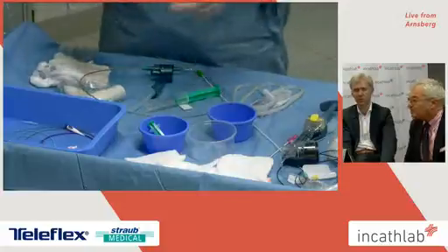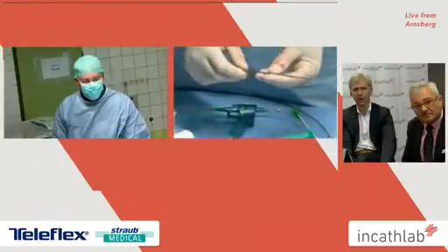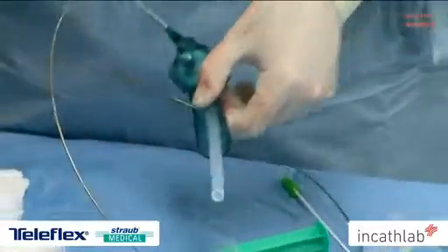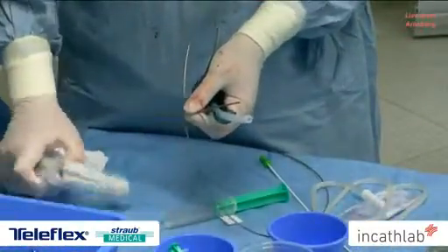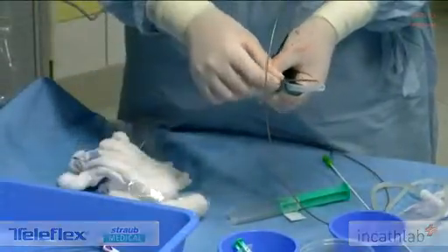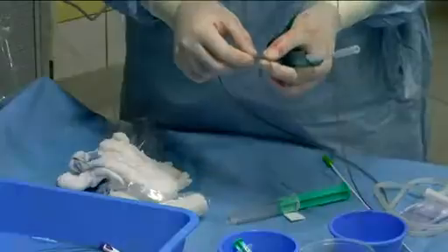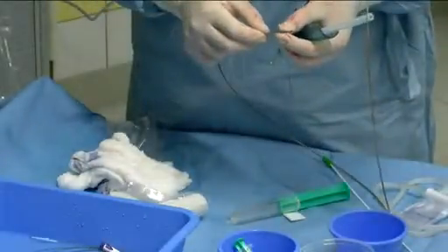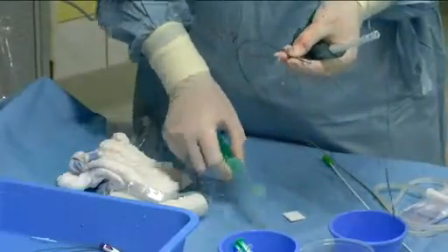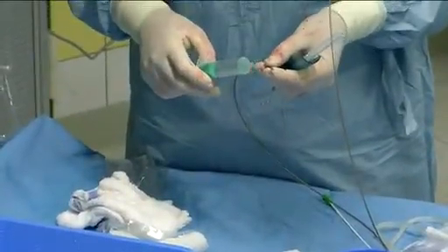Okay. So we are now coming to this case, and maybe this is the important part. Maybe we can turn on the sound again. It's now preparing the Rotarex for a thrombectomy of this bypass, and this is the magnetic clutch which drives the catheter, the Archimedes catheter, inside here. And this is a 6F 135 centimeter long catheter, so that we have the chance to go crossover and use this catheter to really do a thrombectomy of the bypass graft.